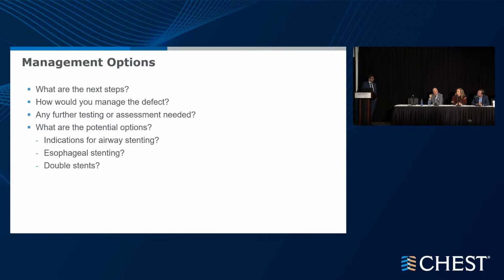Partially covered is not going to cut it because the segment that's uncovered is 7 millimeters proximally and 7 distally. So this one is too close to the main carina, and it's going to leak around. So I think I would go with a fully covered, starting from the main carina, and I don't know, 3-4 centimeters, whatever. And then follow up. Do an esophagram and see what happens.